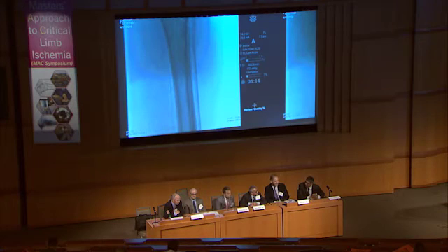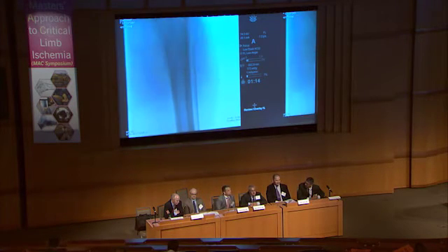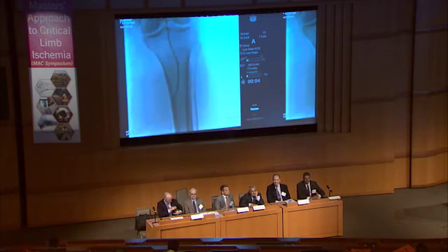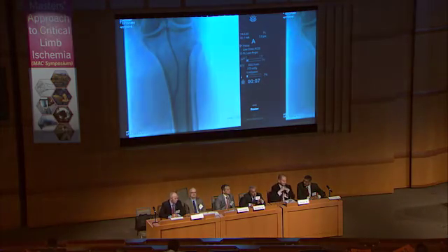So, Dr. Manzi, you brought up the first idea. The discussion today is to go after the below the knee. So, are you satisfied, or do you, with Thomas, want to go for the AT CTO also, which is reasonably doable but slightly more complex than the peroneal and posterior tibial ones? First, I would check the foot angiogram after this dilatation, and I agree with Thomas. We first have to fix the outflow in the posterior and peroneal, and then we could even think to fix the AT and the SFA.